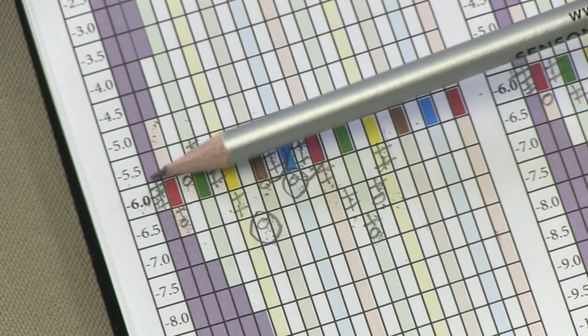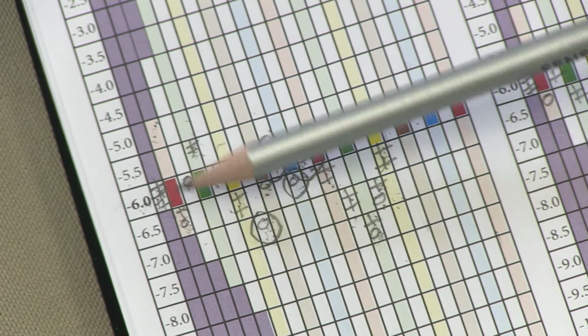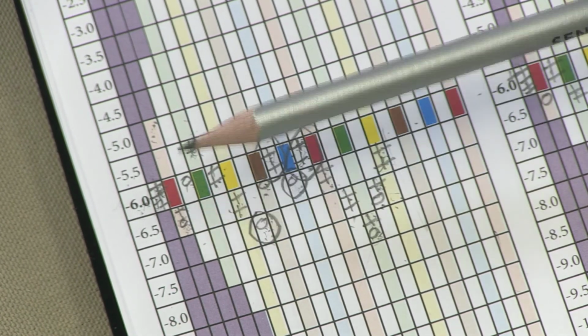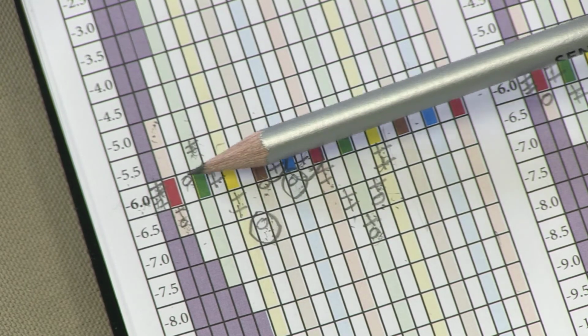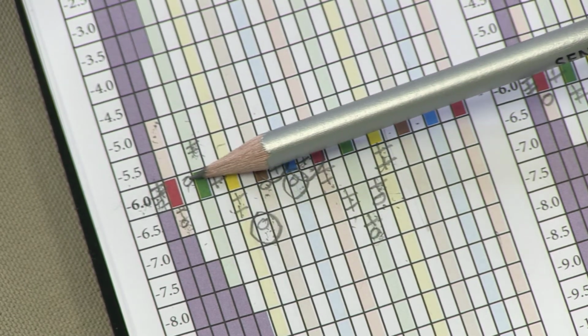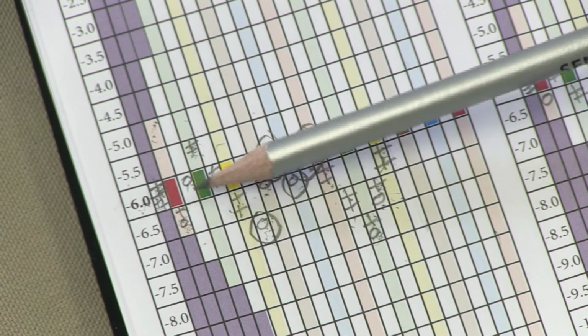So for example, here we had 5 sets of pairs correct. We moved down to the next lowest level, and the second of the set of pairs was wrong, so we moved up to the next level, back at 6 again. Here we missed the first of the pairs, so we didn't do the second pair.